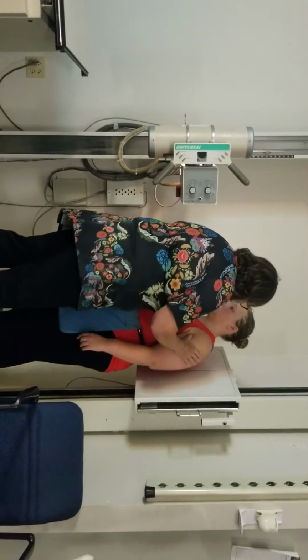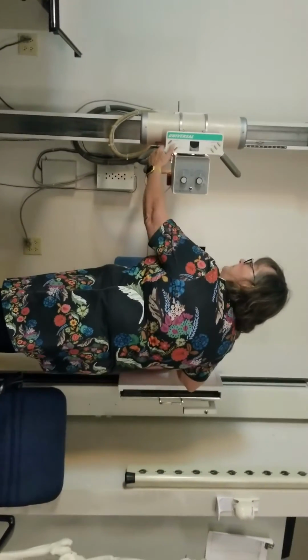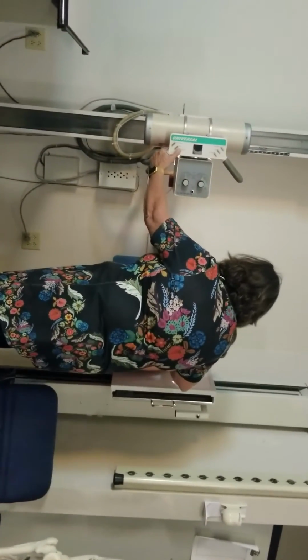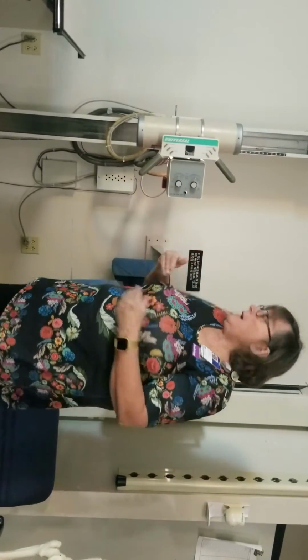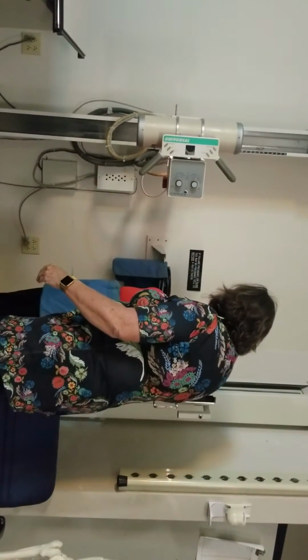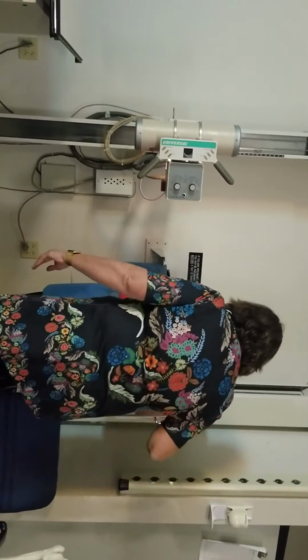Now what we're going to do for the scapula, we're going to center at our axilla. Does everybody know where the axilla is? That is at your armpit. Okay, so armpit, and then we're going to go 2 inches in, so 3 fingers in. So that's where my centering is going to be.